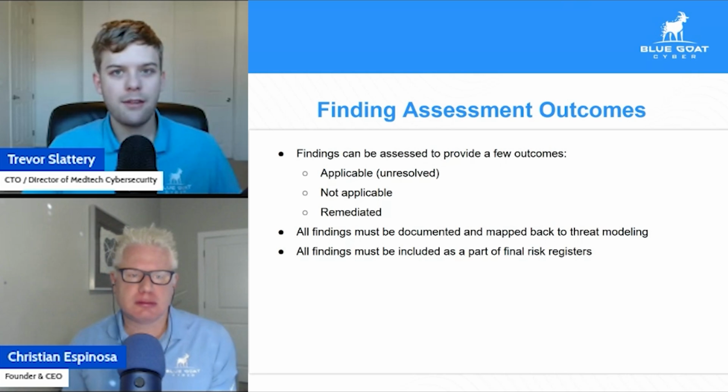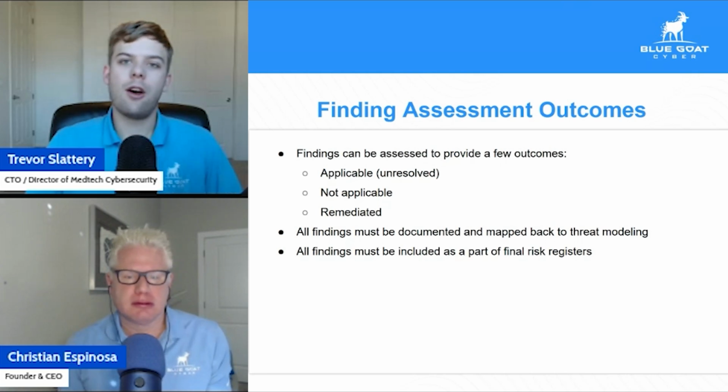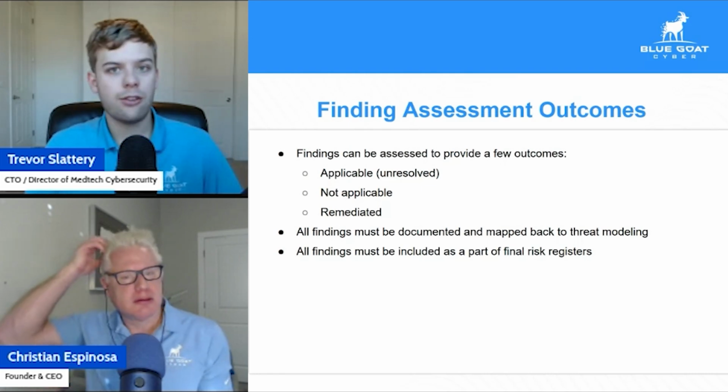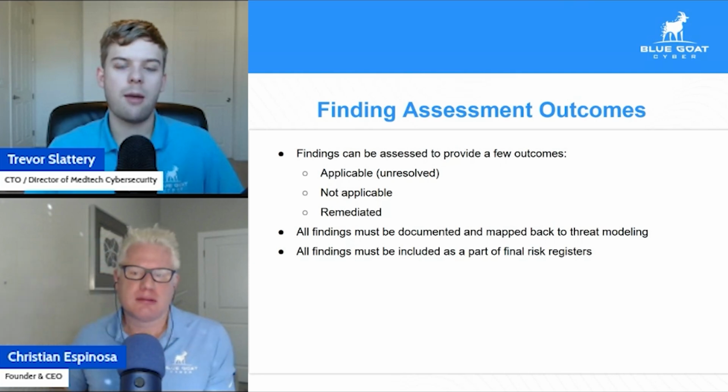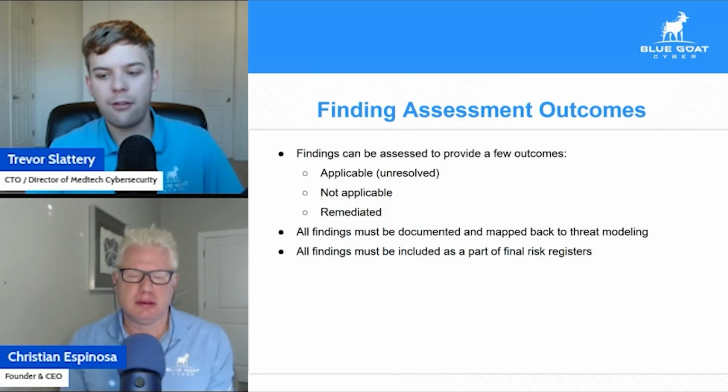So we'll start with a threat. We have our test case to verify whether or not that threat is real. We go from there into the risk assessment outcome. Did we find something? Yes or no? Was it fixed? Yes or no? And what's that final score look like? Why is that final score acceptable? So start to finish in the risk management process, we need to have traceability.